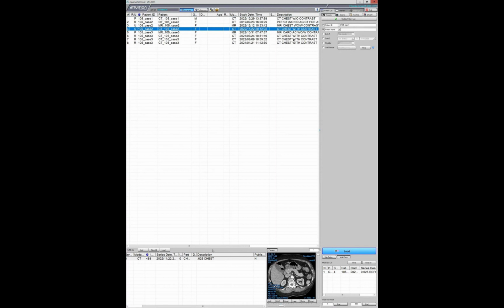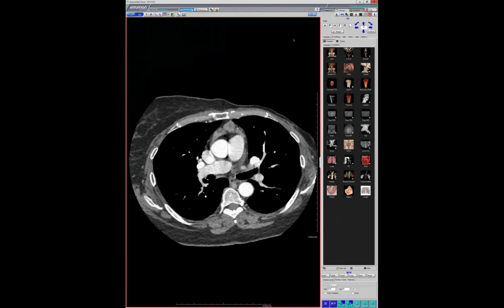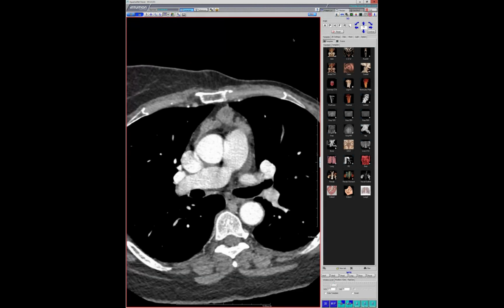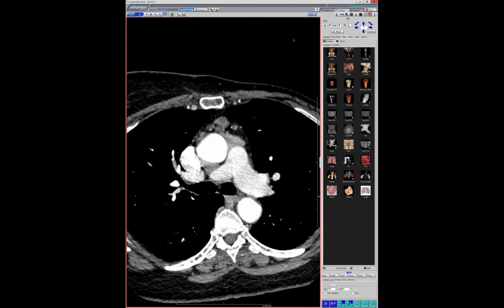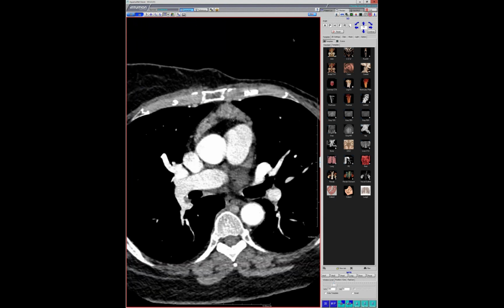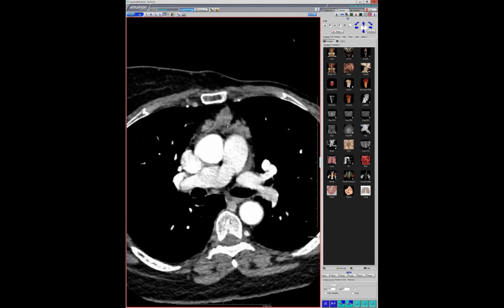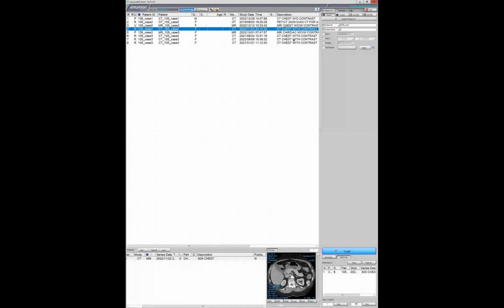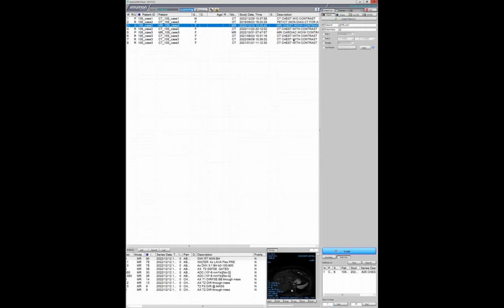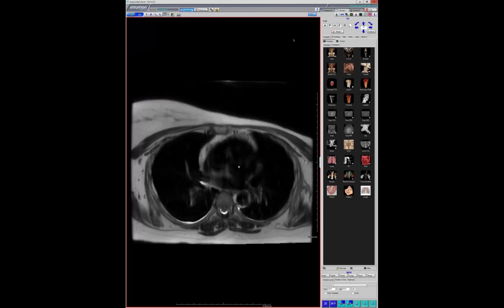So here's the CT. She had breast cancer, and you can see there's more pronounced thymic hyperplasia. But what's interesting is you can see all of these areas of cystic change within the areas of thymic hyperplasia. And if you scroll through very slowly, you'll see there are multiple areas of cystic change within the thymic tissue. Someone raised a concern, which led to an MRI. I'm a little embarrassed to show you the quality of our MRIs.